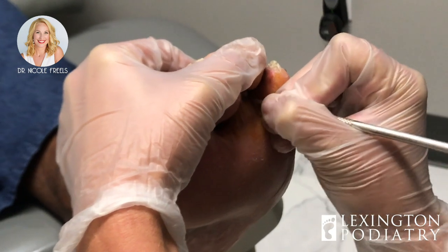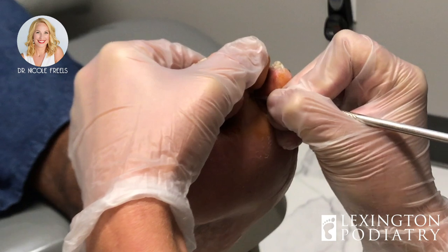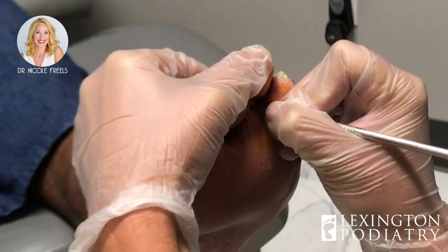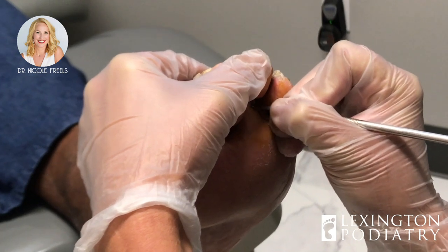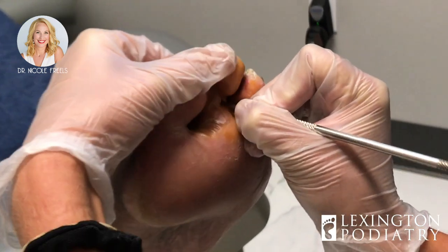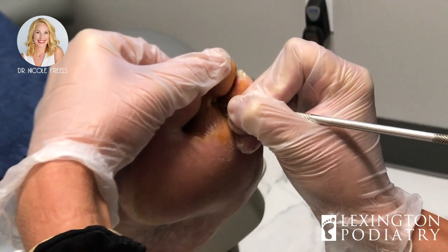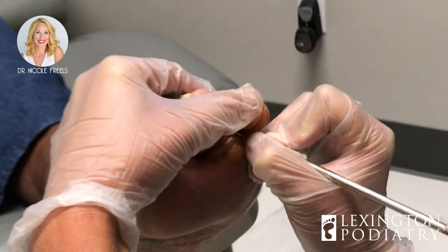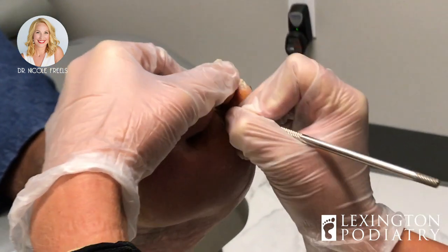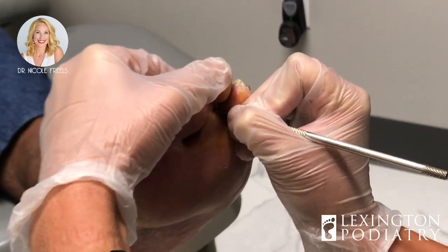There we go. You're going to go home and stay off of this — I've got your work excuse, so you really only need to be off for the week. I can just feel it crunching, and the blade is — there we go. Now look at that, much looser. You can immediately feel a release.